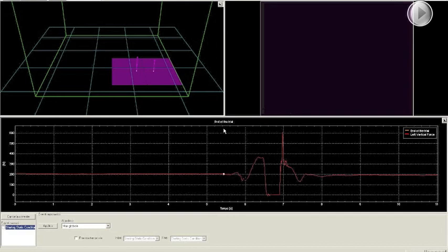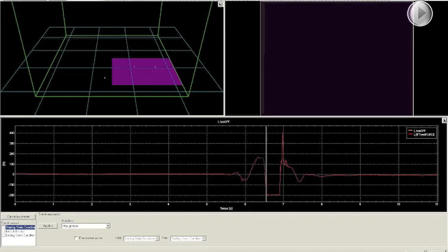So here it's asking me, on the counter movement trial that is here, to select the end of the trial, to detect the static final condition. I click with my mouse and I click OK. Left toe off. Here is when my force goes down and is practically when my vector disappears. So if we look here at the left side, we can see that when my vector disappears on the left side, I have to select the toe off.